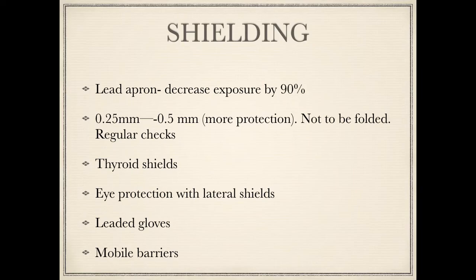Then the other accessory equipment which I use regularly is thyroid shields and eye protection with lateral shields. This is something which I think is ignored quite often, the eye protection, especially the ones with the lateral shields, because fewer people realize that radiation does increase the chances of getting cataract at an early age. So if you're doing procedures regularly, this is something you should not ignore.